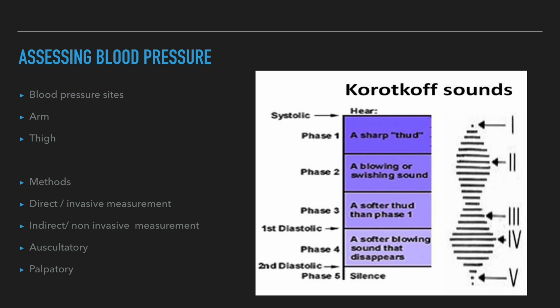When an appropriately sized cuff is used, blood pressure measurements should vary only slightly from readings measured in the upper extremity, unless the client has peripheral vascular disease. Using a cuff that is too small will result in falsely high readings. To measure blood pressure in the ankle, place the client in a flat, supine position, and place a standard arm cuff just above the malleolus. Auscultate or palpate the posterior tibialis or dorsalis pedis pulse as you deflate the cuff. For accurate data interpretation, note the site of blood pressure measurement.